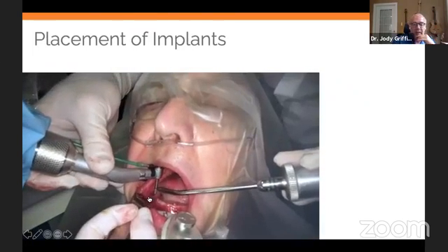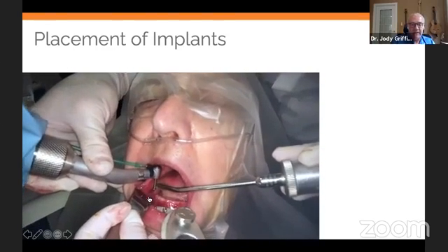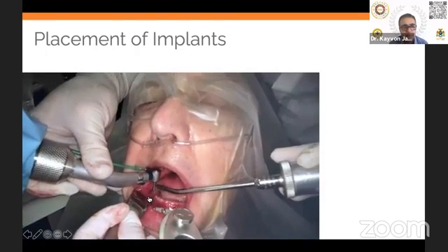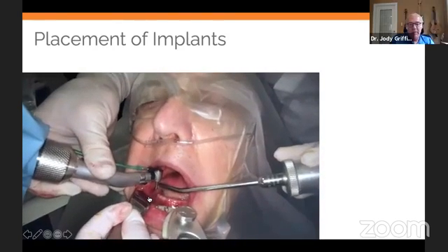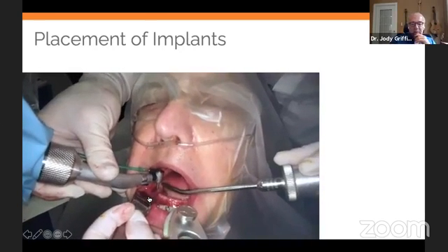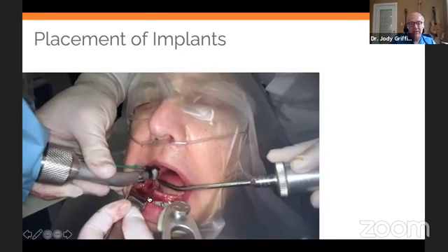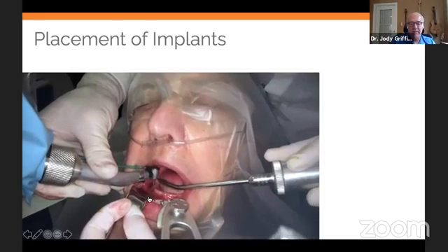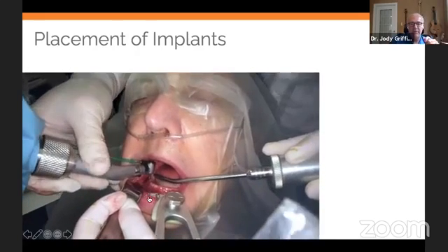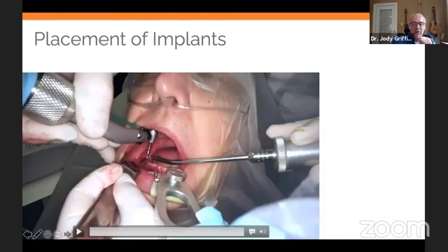So here's the actual implant being guided. It's a very light touch. I'm not gripping that handpiece. I'm not forcing it. I'm very lightly putting pressure apically so that the implant's guided in. You can see with no flap, the implant's fully going to place. When the implant gets to its position, again, you get an audible beep at depth. I apologize that that's not coming through again, and then she hits free and you lift right out. So it is fully guided, in that the implant is also guided completely to place.